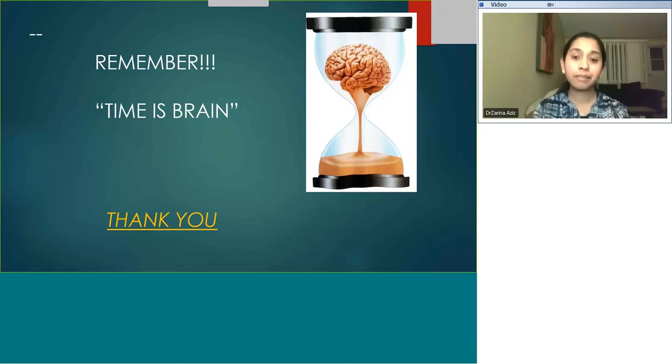So remember, time is brain, all about faster reperfusion, faster imaging, faster interpretation. So acute imaging in stroke is all about time and correct knowledge of the anatomy and scoring of the infarcts.